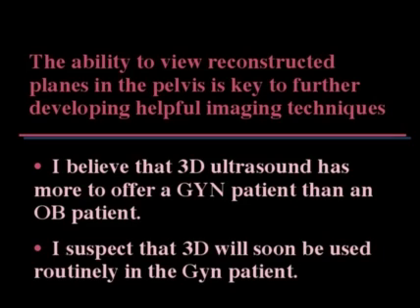3D has been used in CT and MR for years, and now we can bring ultrasound into the era of other forms of cross-sectional imaging. Thank you very much.